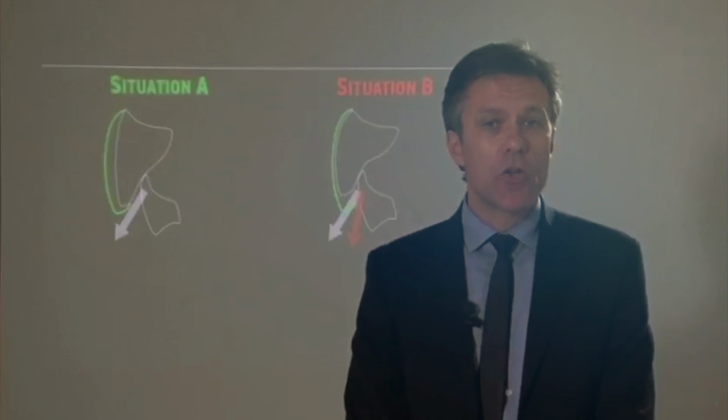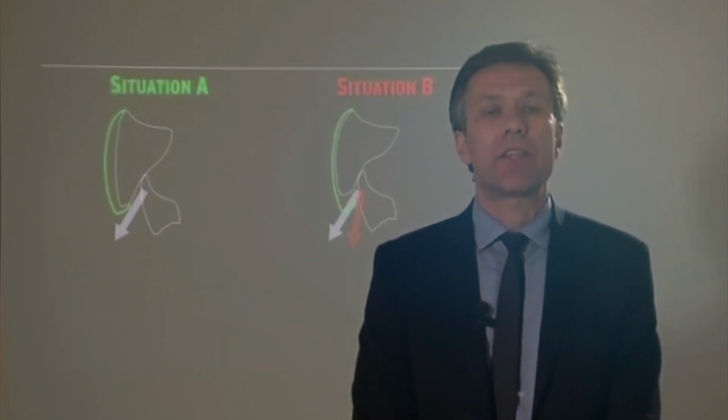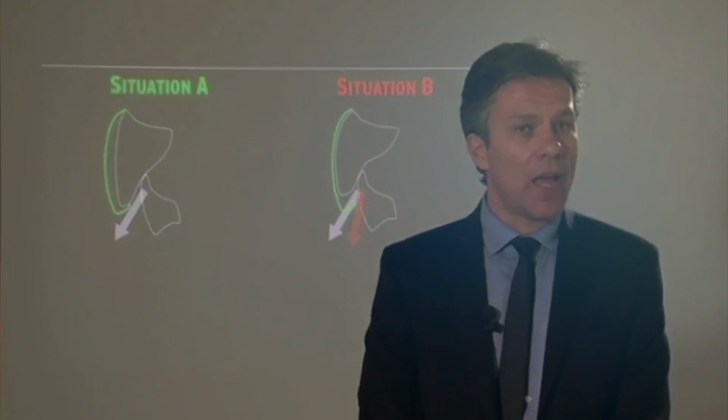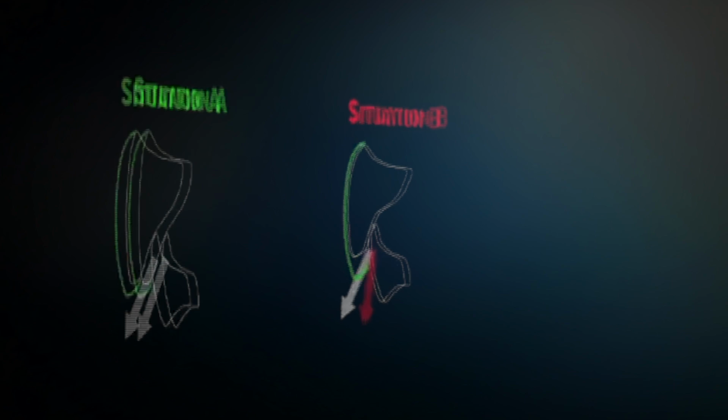So that's why it's so important for us to test how much you have to increase the length of the centrals, the length of the anteriors, because all the rest of our wax up, all the rest of our treatment will depend on this decision.